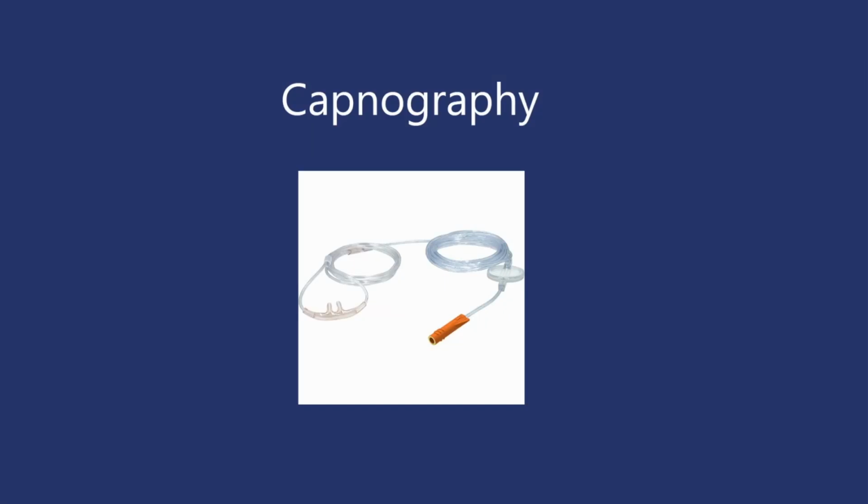All right, so for this, we're going to start talking about capnography. Capnography definition is we're talking about exhaled carbon dioxide. We're measuring carbon dioxide as somebody's breathing in or out. So to briefly talk about how capnography is getting our reading, we have two kinds of systems.